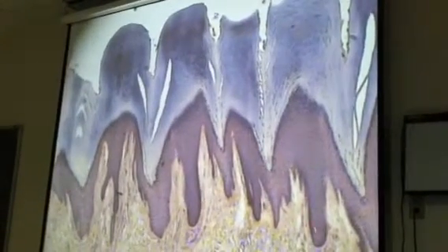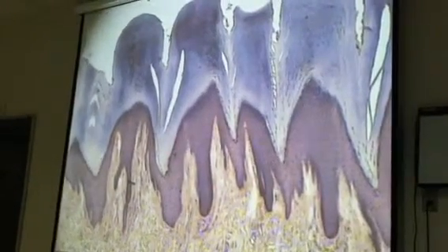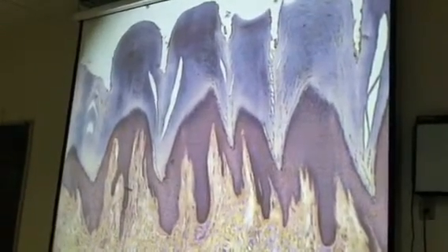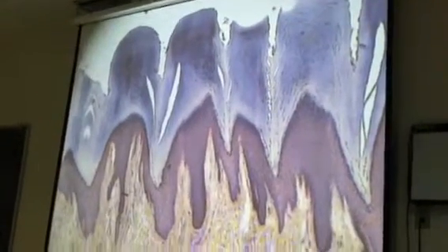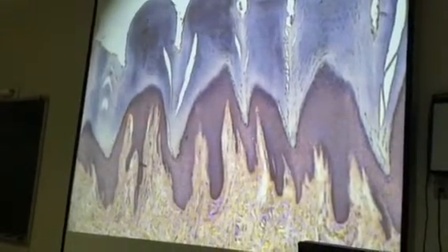That's what that is. Okay, so here, this is where the tissue starts, the epithelial tissue. This is keratinized stratified squamous epithelium, all of this, from here all the way up to there. Even though it's dead, it's still considered that. Okay, and this is the surface of your skin up here. And then this is the dermis down here. That underlying areolar tissue, there's just a little bit of it. It's going to be right down under here.